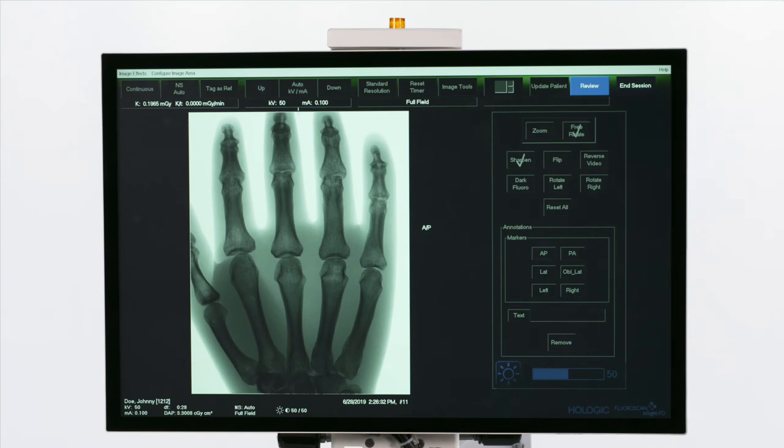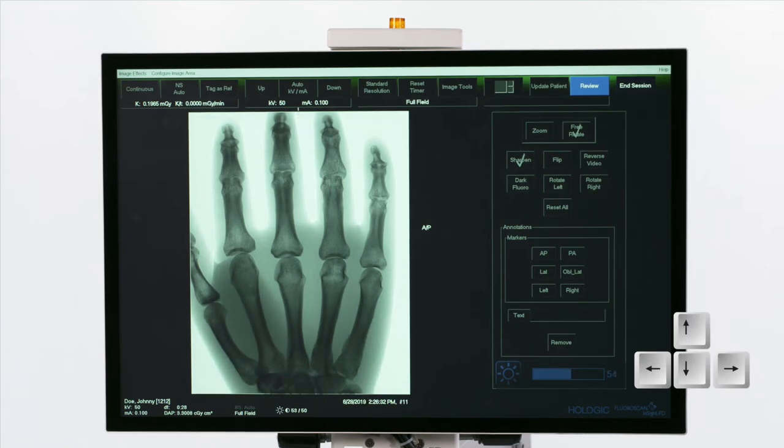To adjust the brightness or contrast, you can use the monitor or the keyboard. On the keyboard, use the up and down arrows to adjust the brightness, or use the left and right arrows to adjust the contrast.